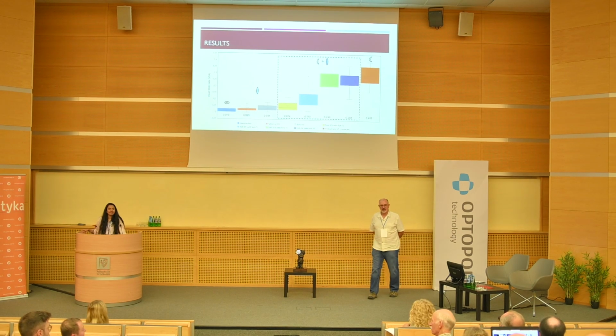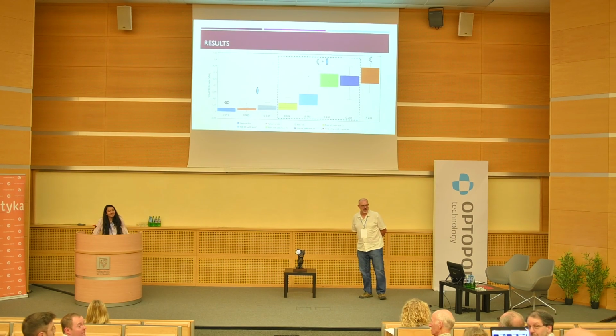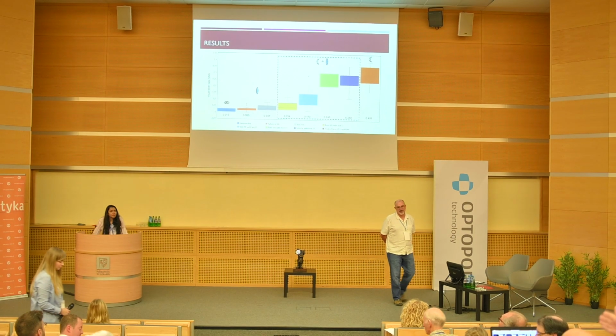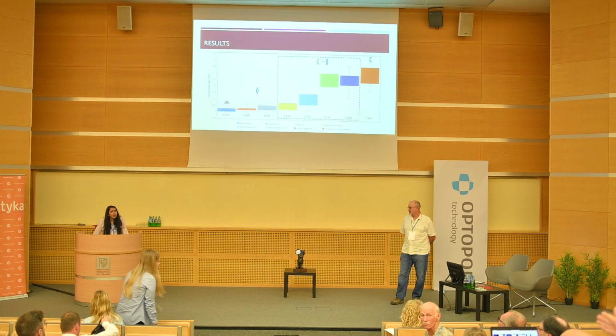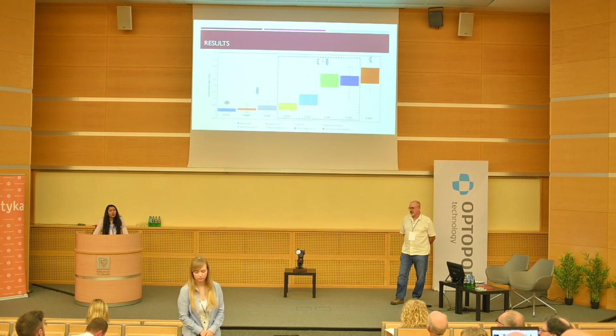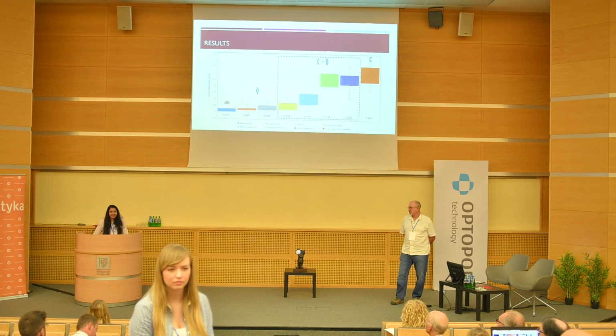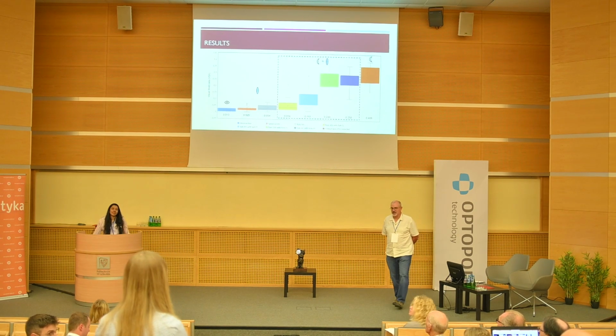That was actually my question. I had the same question. So when you introduce the spherical IOL, you are introducing extra spherical aberration that is not corrected by the contact lens. So if you would redesign the contact lens to compensate for the spherical aberration introduced by the intraocular lens, you would have the same result.